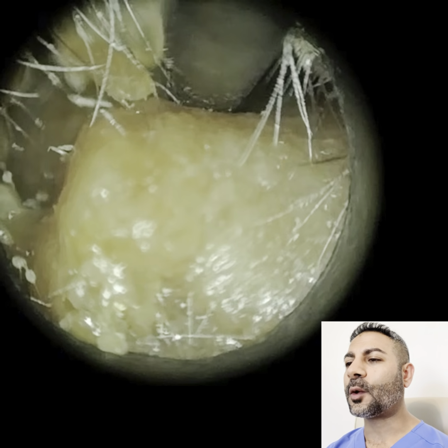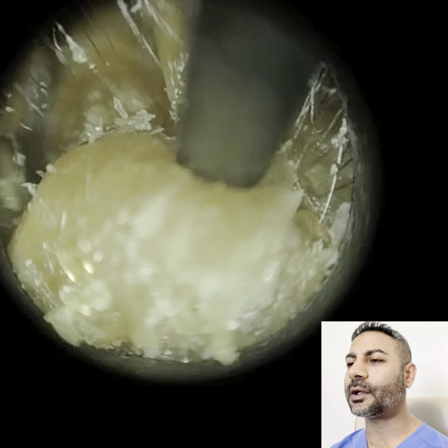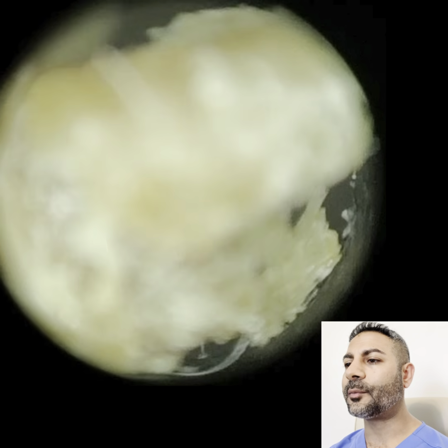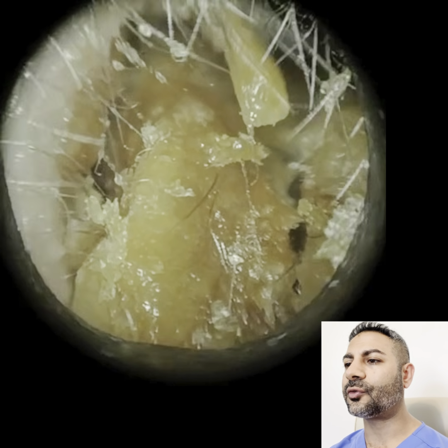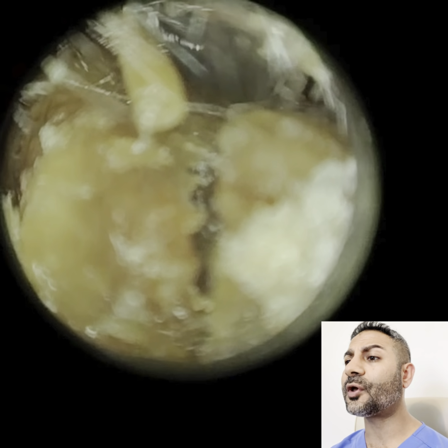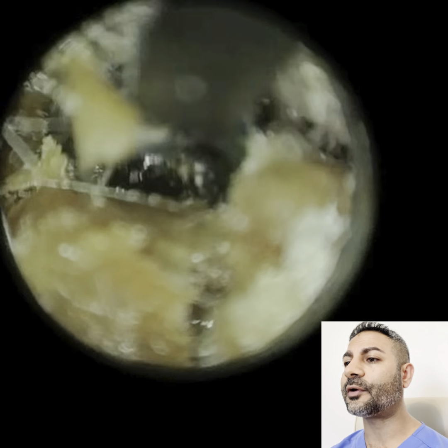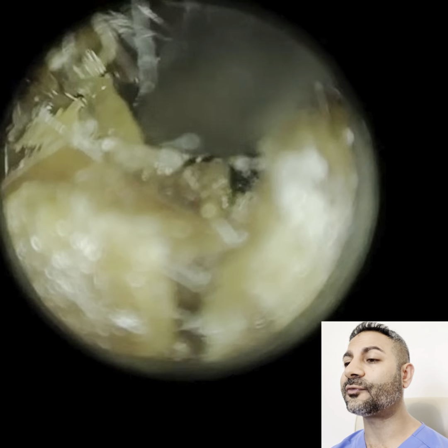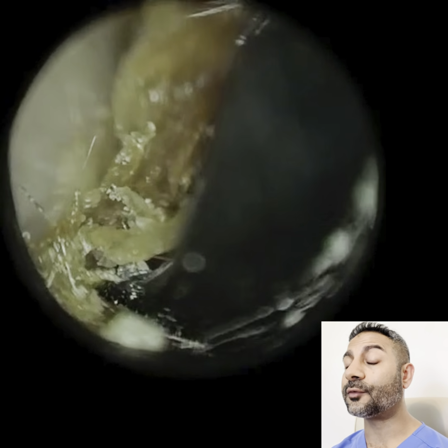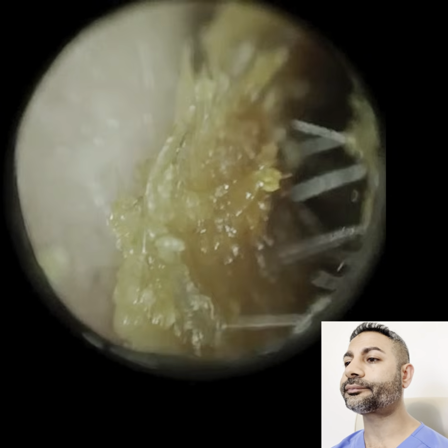Now, with the wax, particularly on the right side, which I'm also going to show you, the wax is quite crumbly on that side. Here, it did remove some of the wax, but it also did dissect through another section. So I am also going to use a curette on this side. So I'm just focusing a bit deeper. You can see there's a bit of an opening there. So I'm just inserting the curette over and beyond as much as I can safely, and then slowly bringing this wax forwards. With the curette, you've got a bit more surface area because of the shape of the tip.